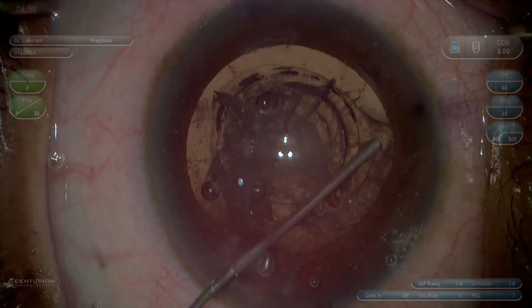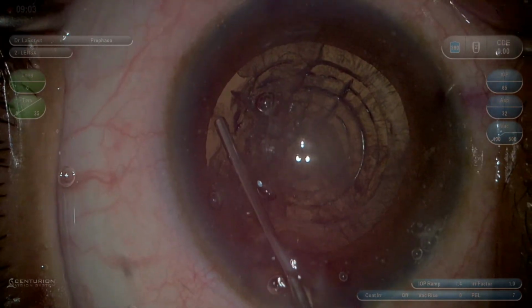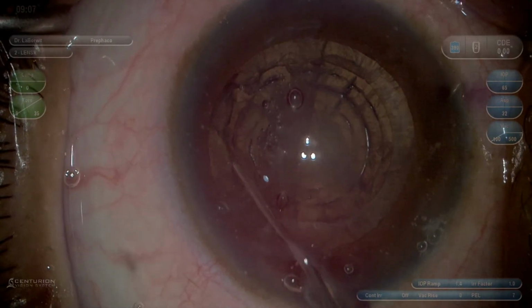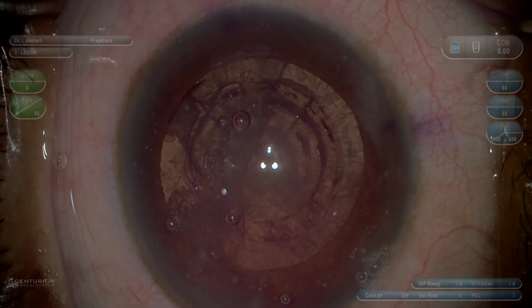I do not hydrodissect. I use viscodissection to the equator and use the air bubble from the femtosecond to allow for pneumodissection posterior. I'm trying to stay away from the area a little bit where I think there might be not a complete continuous capsulotomy.